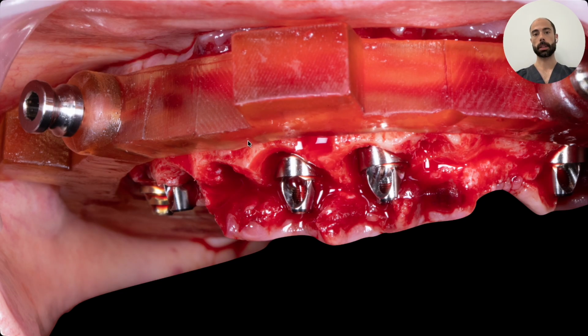After the bone reduction and implant placement, we're left with this: implants in position, bone leveled, soft tissue open. And now comes the part that most full-arch courses skip entirely, the soft tissue game. Because FP1 is not just about the bone, it's about what sits above that bone, and the tissue that will define whether this case looks like a prosthesis or looks like teeth.